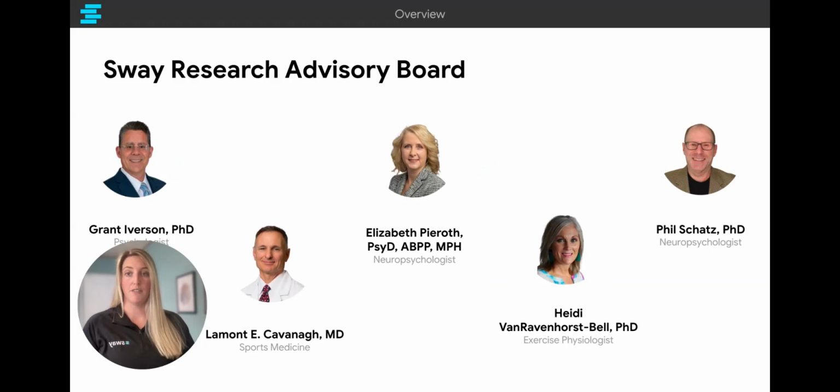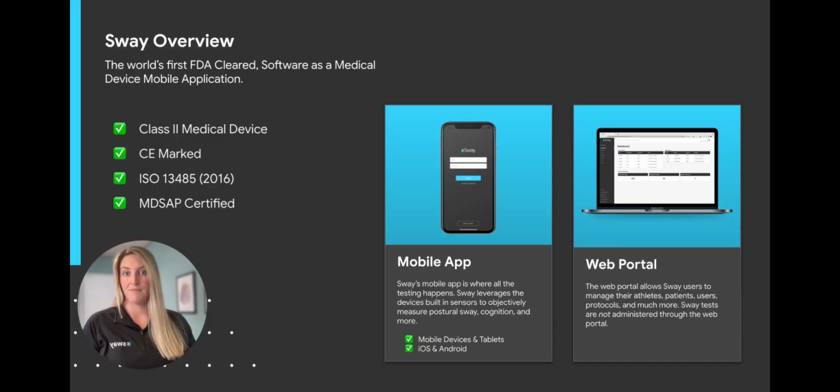This is a few of our members of our research advisory board, mostly all in the concussion realm. Some really big names here, and very privileged to be able to have this group advise our product to be pushed in the right direction. So for Sway, just from an overview standpoint, there's always a mobile app where the testing data can be seen and the test has to be administered. As healthcare providers, you also have access to all of the data on a secure web portal.